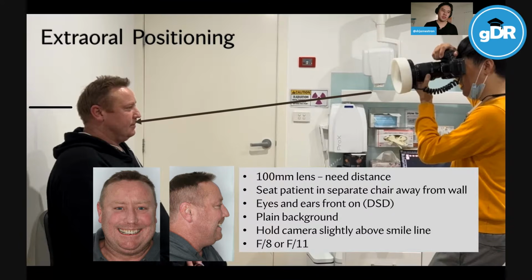Whereas you might have seen some other photos, maybe if your patient's lying in the chair and you're trying to do a photo where they're lying in the chair or even sitting up, you'll see the smile lip is really flat or even like a reverse smile because you angled it down up.